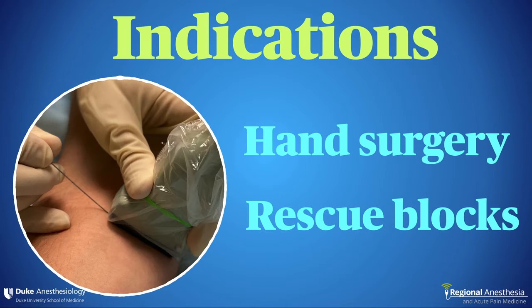There are two principal indications for doing these distal blocks. Hand surgery is the main one. One advantage over a brachial plexus block is the patient retains the ability to move their upper extremity, which is a huge satisfier. You can also mix and match the individual nerves to suit your specific surgical needs. There is nothing more satisfying than getting a patient through their fifth finger pinning when your entire anesthetic is three mils of bupivacaine on the ulnar nerve.